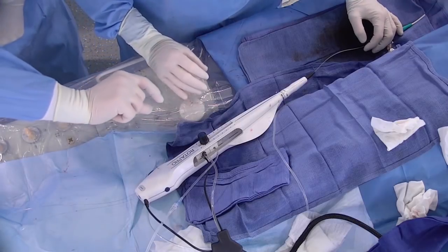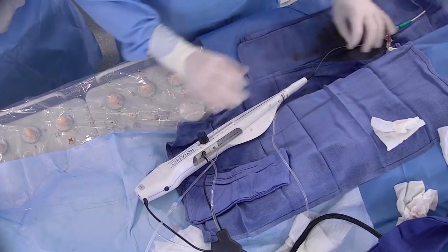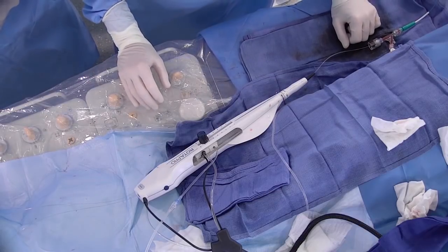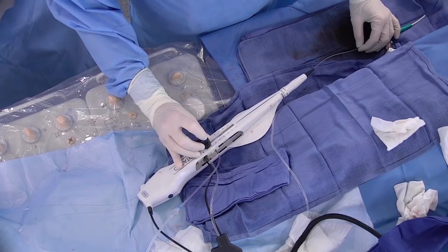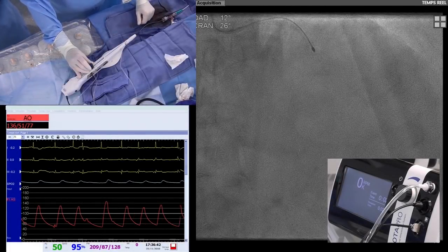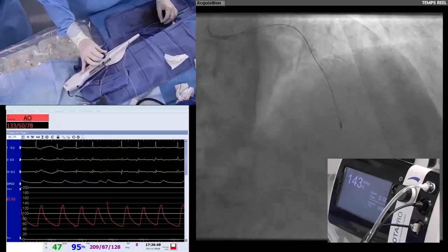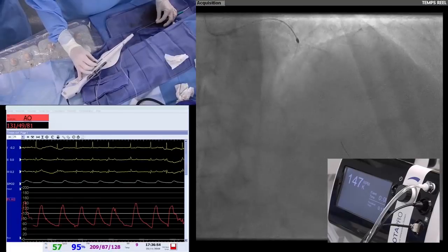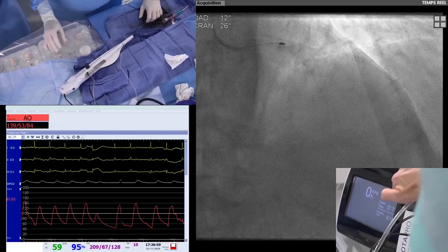So basically, you don't break it, right? No. You don't fix it. You let it open. And thanks to that, you can advance it slowly, more distally. Sometimes, especially in a distal RCA lesion, it's difficult to advance the burr distally. So I do that after crossing the proximal lesion, of course. Thanks to that, I will go more distally, as you can see, very easily. Now the sound is very good. It looks terrific. And I think we will now place the workhorse guidewire.